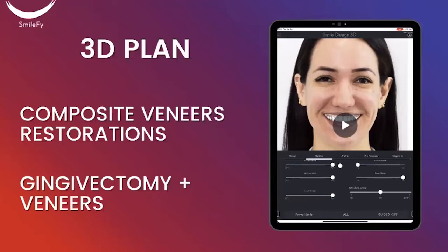If you have any questions on how to get the CT bone file, ask George, he's in the chat. We have a partnership with DiagnoCat, and he can give you more explanations on how you can convert your DICOM file, your CT file, into a bone file and apply that into your cases using SmileFy software.